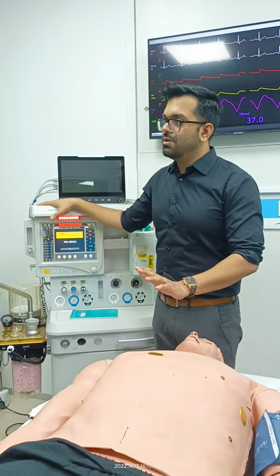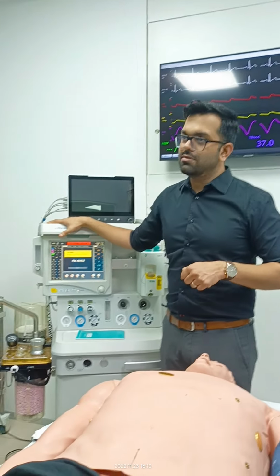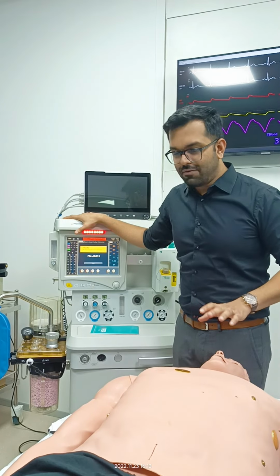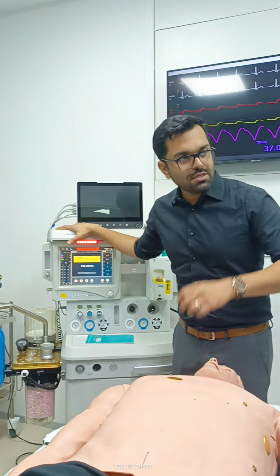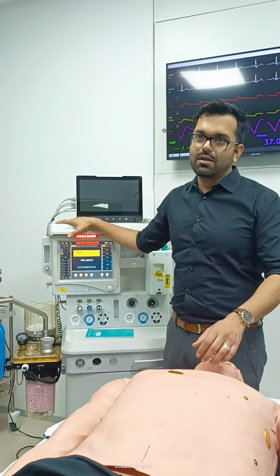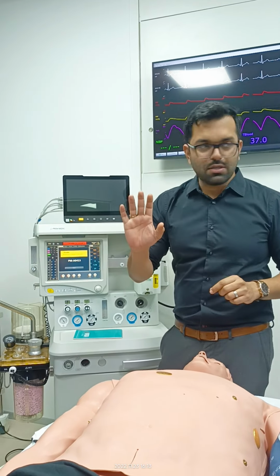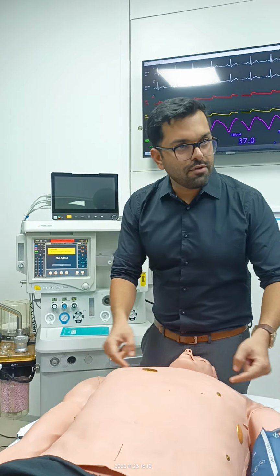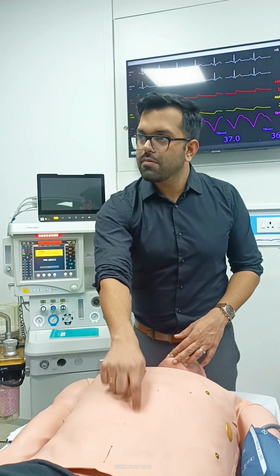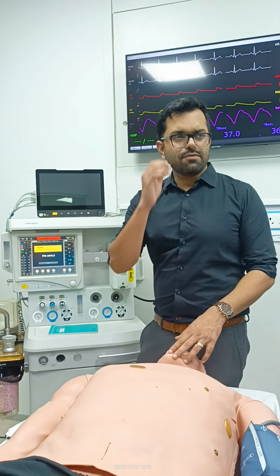We are still not sure whether your novice anesthetist has inserted the tube in the right bronchus or it's in the trachea. Not in the left, in the trachea. It very rarely goes into the left, it always enters the right if you push it further in. So how do you confirm whether both these sides are adequately ventilated? Bilateral, yeah, so we auscultate. Bilateral 5-point auscultation. You remember that? Infraclavicular, infra-axillary and epigastric. Will you get anything here if there is endotracheal intubation? No. This is to confirm that there is no esophageal intubation.